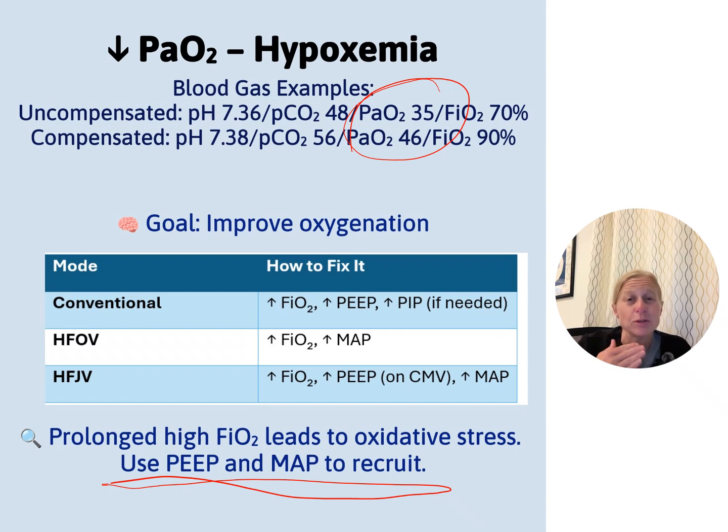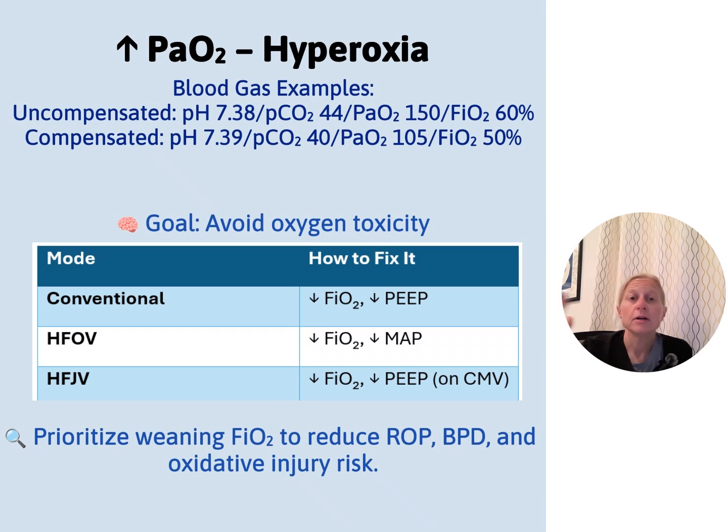And so that's really what I think about when I need my gases to exchange. What is with hyperoxia, right? You see these high levels going on. We have our PaO2 at 150, 105. We have high oxygen requirements at 50 and 60%. They're not scorching high, but in general, we want to make sure that our SpO2 and our PaO2 are kind of matching each other.